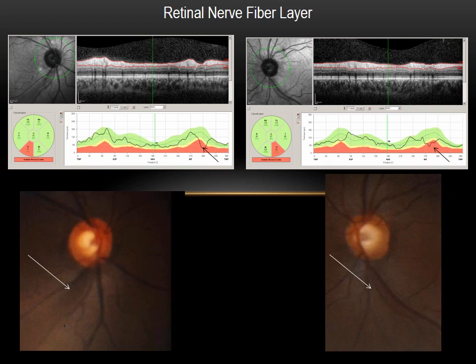We typically assess the presence of glaucoma using a peripapillary measurement using OCT, where we measure around the optic nerve. The display of the nerve fiber layer thickness shows us, compared to the normative database, a drop in the thickness inferiorly in both eyes of this patient, as shown by the black arrow. The color pictures of this patient also demonstrate the nerve fiber layer defects very easily, as pointed out by the white arrows. However, this relative ease of visualization is not always the case in many of our glaucoma patients.